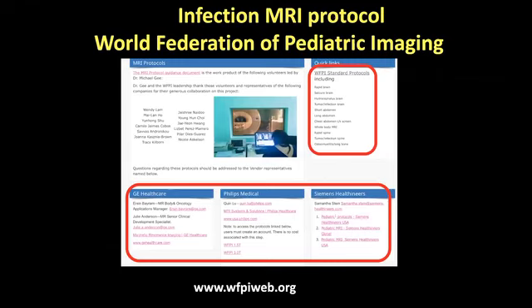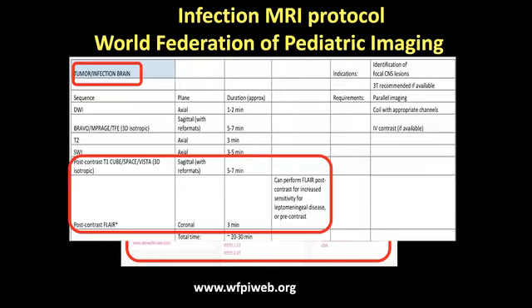And one other resource I would like to draw your attention to is the World Federation of Pediatric Imaging. On their website are MRI protocol guides, and these are quick MRI protocols, rapid brains. The protocols have been set up with the major vendors. And when you go onto here, for example, it's going to give you options for tumor or infection and very fast scanning. And using this, you can then go to your own vendor's recommendations for the sequence parameters.